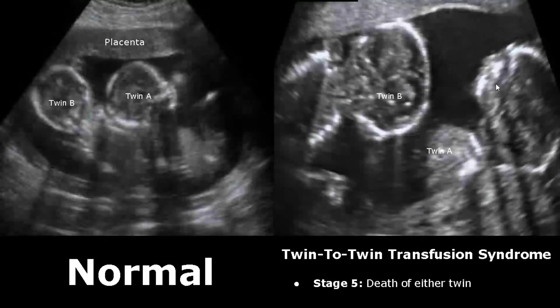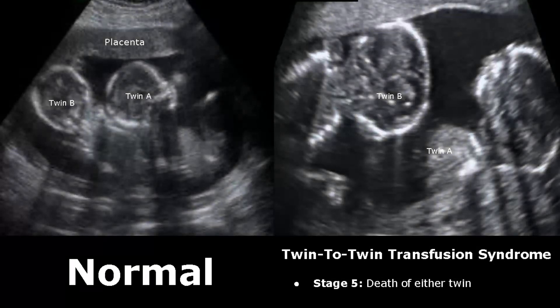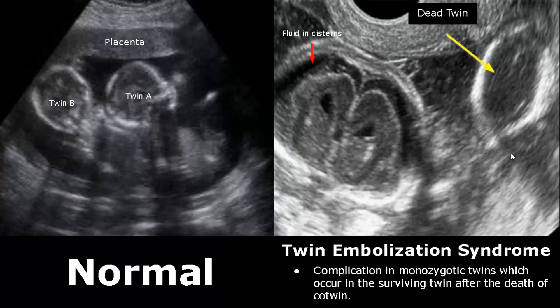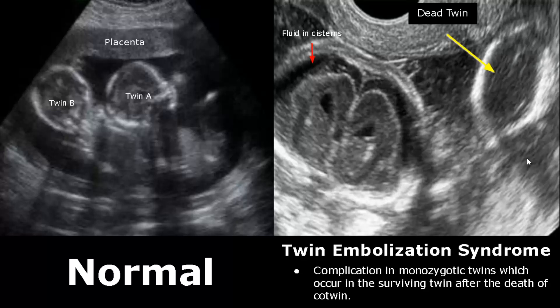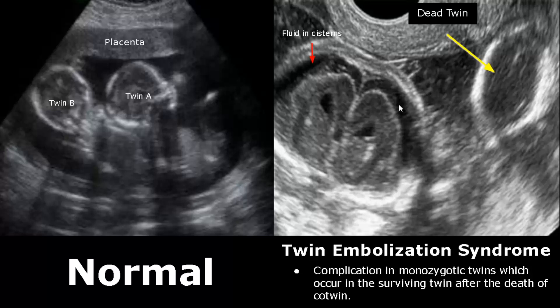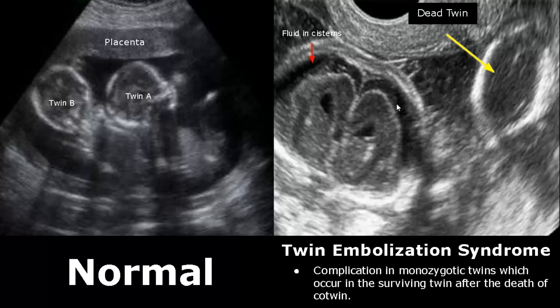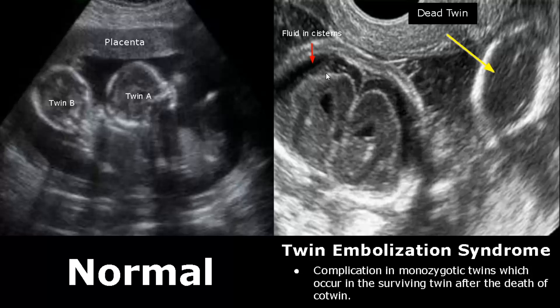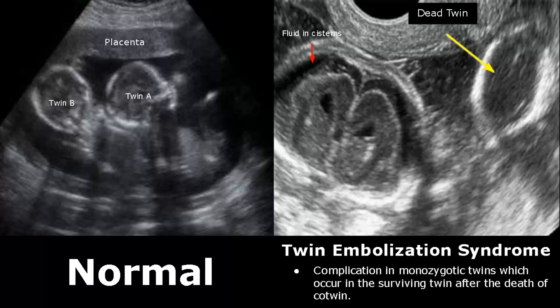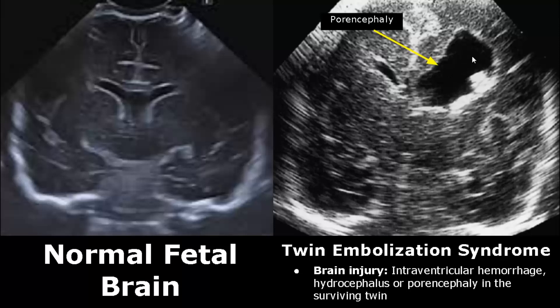In the final stage of twin-to-twin transfusion syndrome, death occurs in either twin. Twin embolization syndrome is a rare complication in the surviving twin after the death of the co-twin. The damage is actually ischemic rather than embolic. Most commonly, brain injuries are involved, including intraventricular hemorrhage, hydrocephalus, or porencephaly. Here we see fluid in the cisterns of the brain, suggesting brain injury.